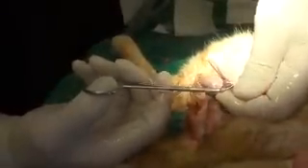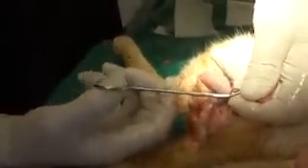The testicles all shaved, and we prep them. It's not as much of a surgical prep or surgical procedure as a spay is, because there never seems to be any problems. We just cut right over the testicle, and the testicle starts to come out of both sides like that, and then we pull, and the secret is to come on the same side, and then you clamp it up above like that.